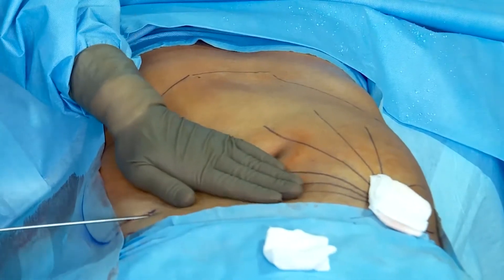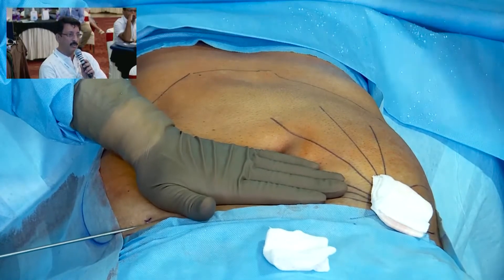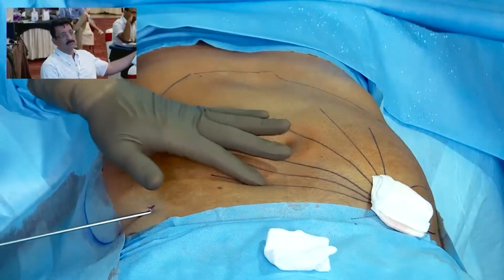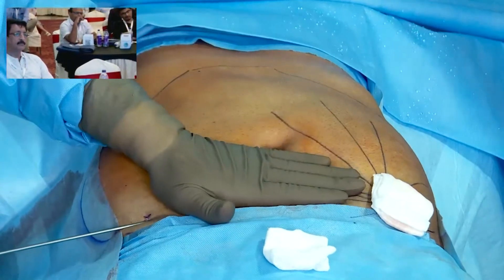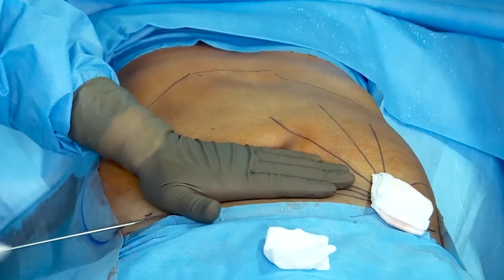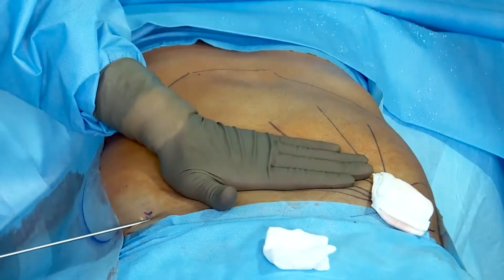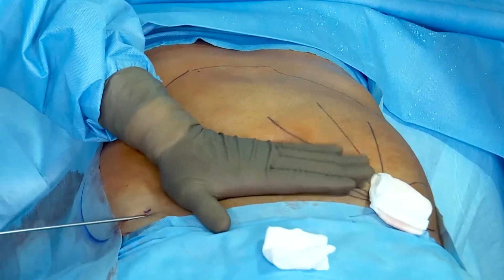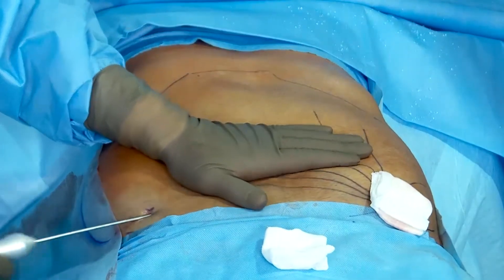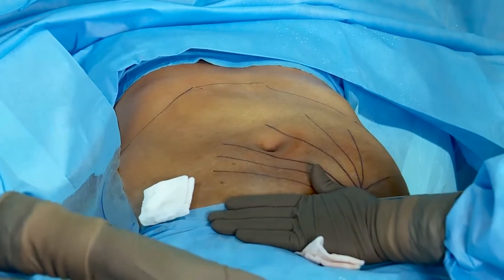Regarding the left hand: it is stabilizing the skin, applying a little pressure, and I am feeling the cannula throughout so that I do not go in too deep. I am pressing it slightly down so that the rectus and the abdominal muscles are pushed further down. If you have done proper marking beforehand, you know where to go and where not to go.